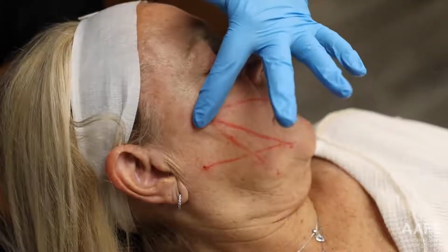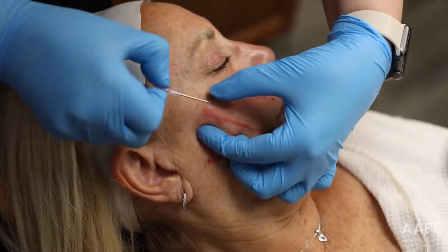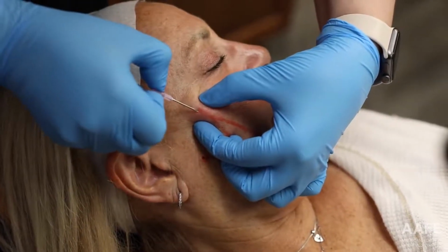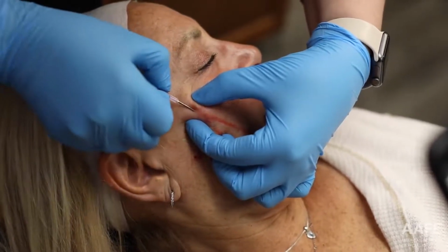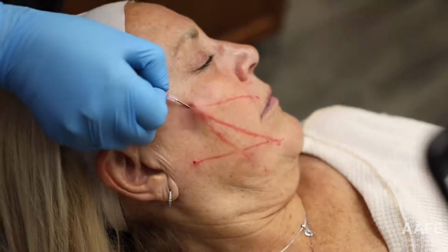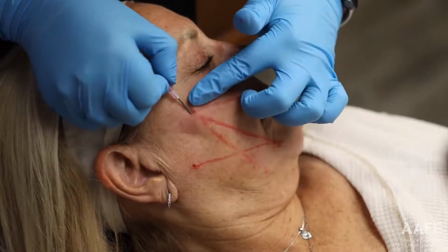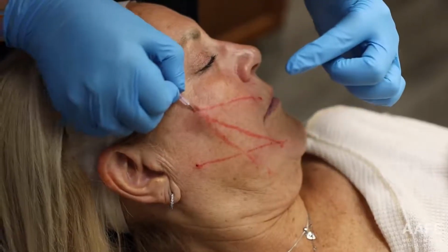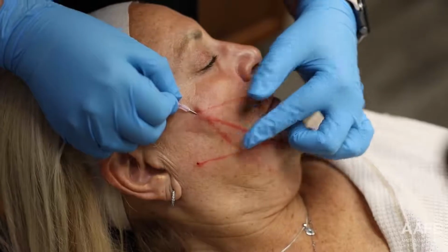Okay, so she was just numbed with some lidocaine, so now I'm going in with an 18 gauge needle, pinching up the skin, and it's almost like I'm starting an IV, little pressure. So she was numb, so she shouldn't really feel that. She might feel a little bit of pressure just from the insertion site, but typically not any pain. And I'm just going down each of my vectors and kind of opening up that space a little bit so that my cannula can easily slip in there.